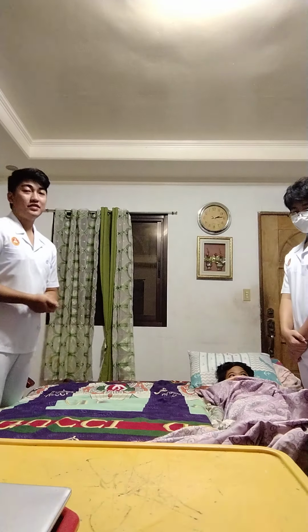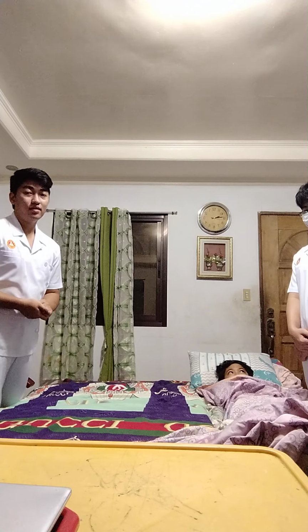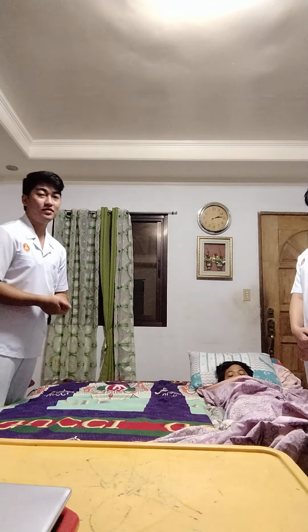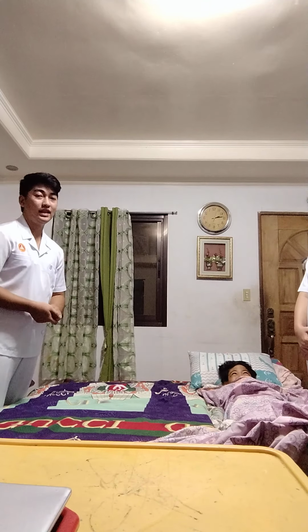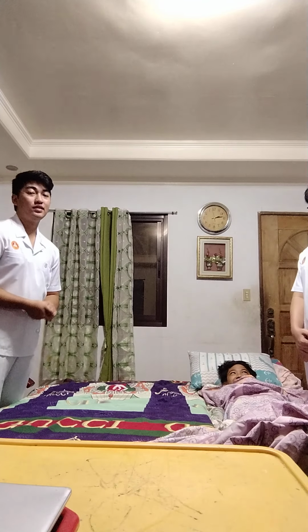So, once the patient is transferred to the stretcher, remove the transfer board and secure the patient until the side rails are raised. And raise the side rails to ensure the patient's comfort and cover the patient with blanket and remove the bath blanket from underneath. And leave the friction reducing sheet in place for the return transfer.